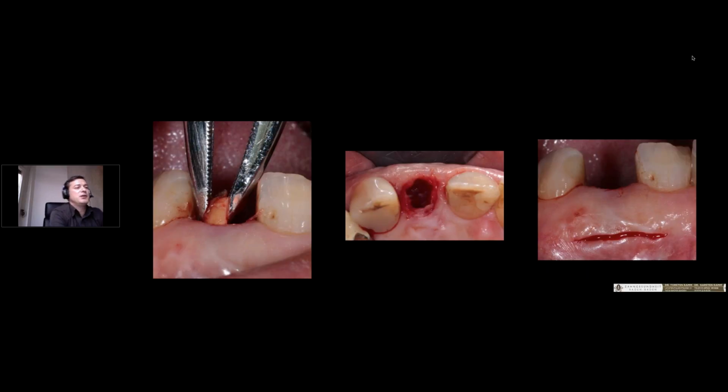If you look at the last picture on the right side, looking from outside, you see no touching, no bleeding, no destroying, and also if you look inside the socket, you see no blood inside, and that is important. If you have good cleaning and a very atraumatic extraction, you don't get much blood inside. If you have so much blood inside, you have much more destruction of the soft or hard tissue. And it's not very good for the aesthetic results after 1 or 2 weeks.